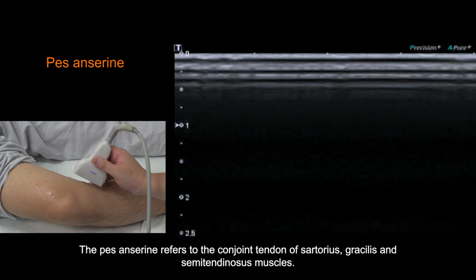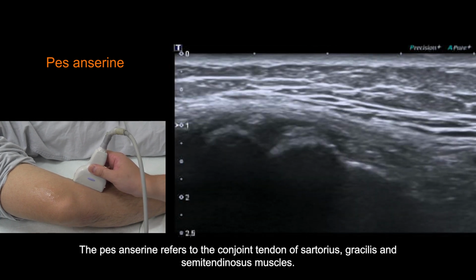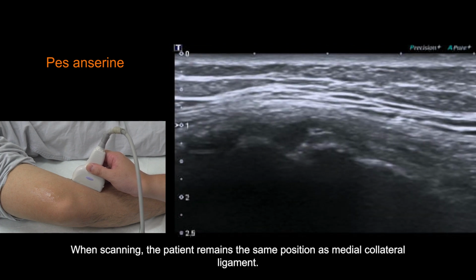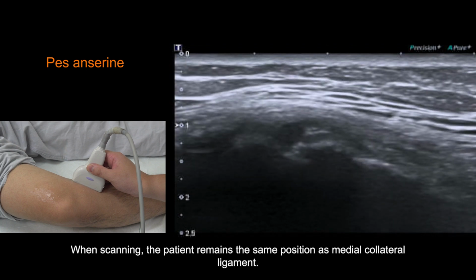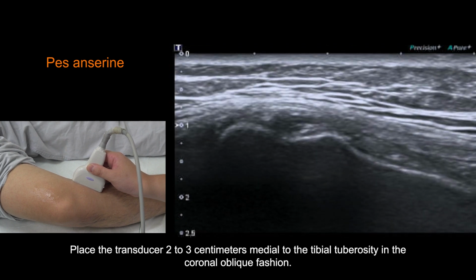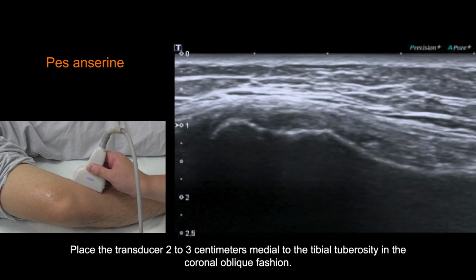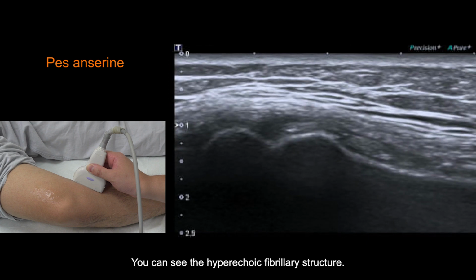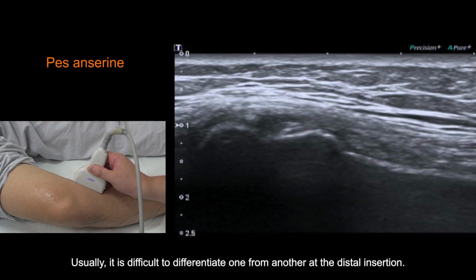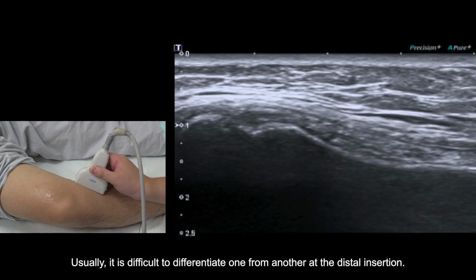The pes anserine refers to the conjoint tendon of the sartorius, gracilis, and semitendinosus muscles. When scanning, the patient remains in the same position as for the medial collateral ligament. Place the transducer 2 to 3 cm medial to the tibial tuberosity in a coronal oblique fashion. You can see the hyperechoic fibrillary structure. Usually, it is difficult to differentiate one from another at the distal insertion.